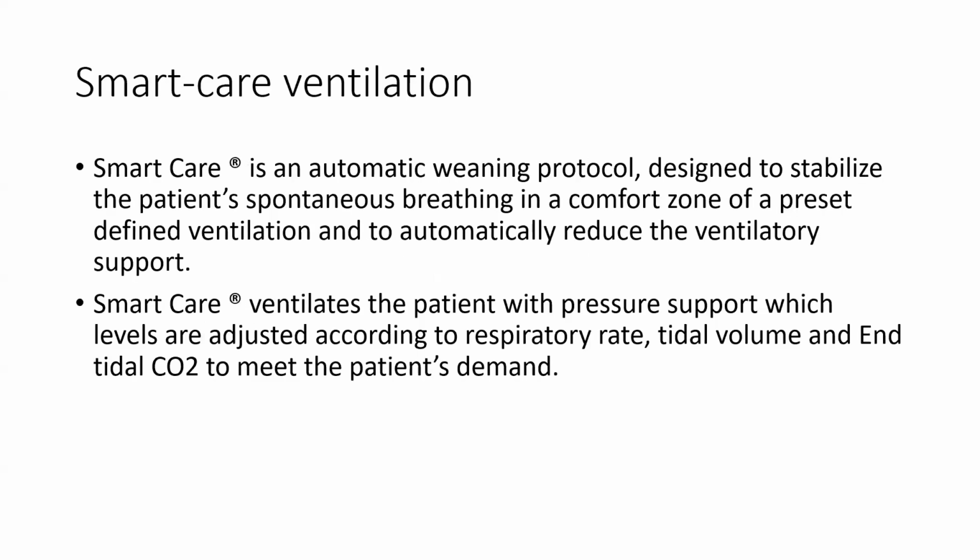Now, SmartCare. SmartCare is an automatic weaning protocol designed to stabilize the patient's spontaneous breathing in a comfort zone of pre-defined ventilation and to automatically reduce the ventilatory support. SmartCare ventilates the patient with pressure support, whose levels are adjusted according to respiratory rate, tidal volume, and end-tidal CO2 to meet the patient's demand.